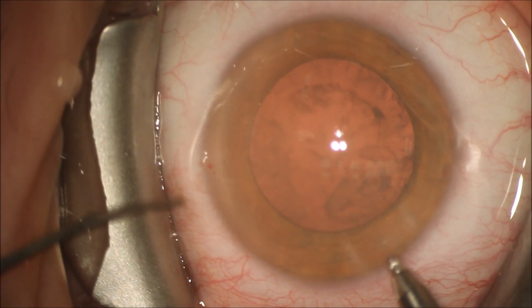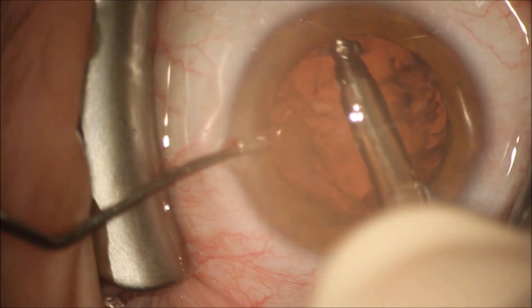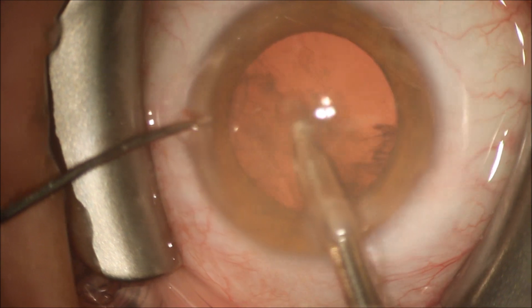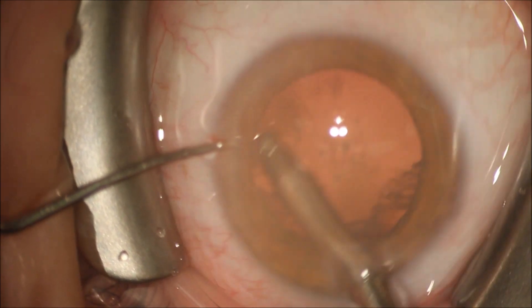We'll remove this with an automatic irrigation aspiration handpiece. You can see we're moving the cortex in a circumferential fashion from the outside in using this irrigation aspiration handpiece.